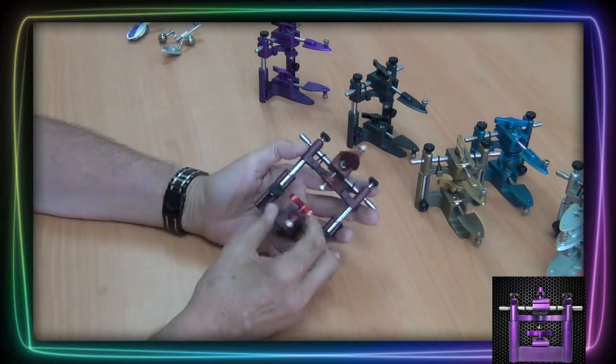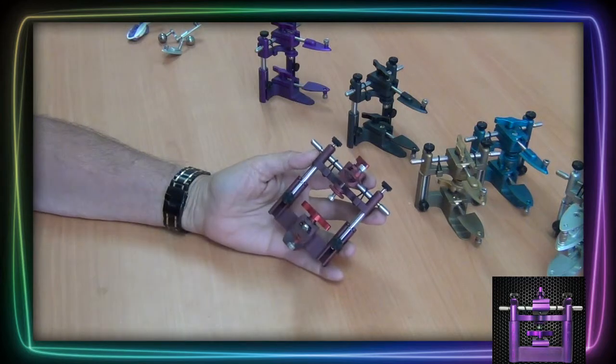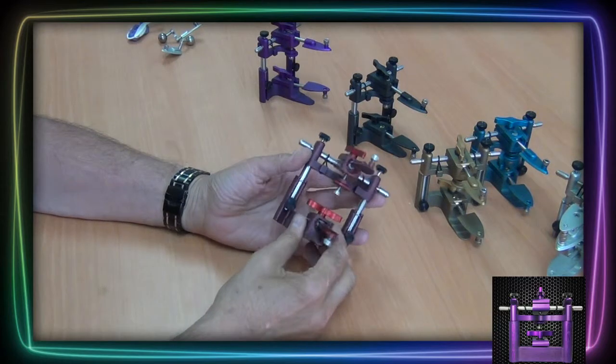The Enzo Articulator is so versatile that it can accommodate any kind of model system. As long as you're able to glue the plastic female on a base, it will articulate very effectively.